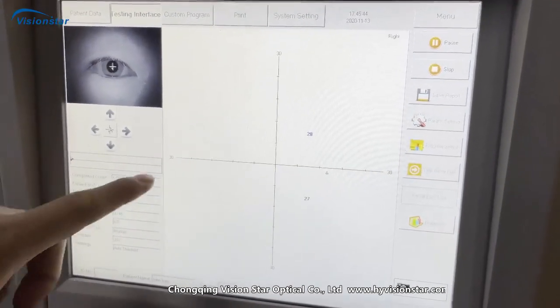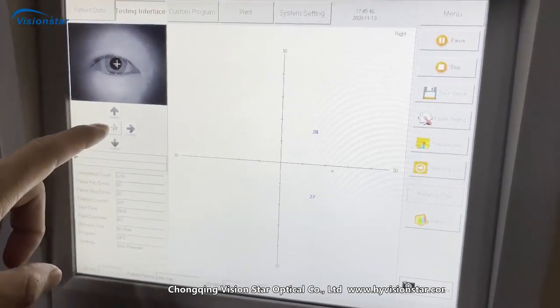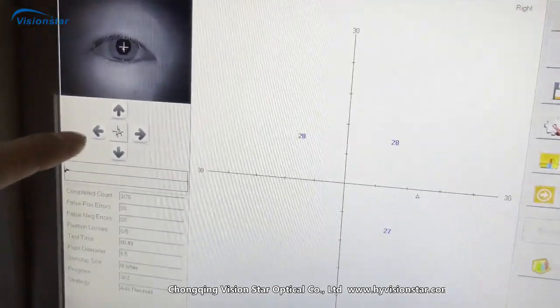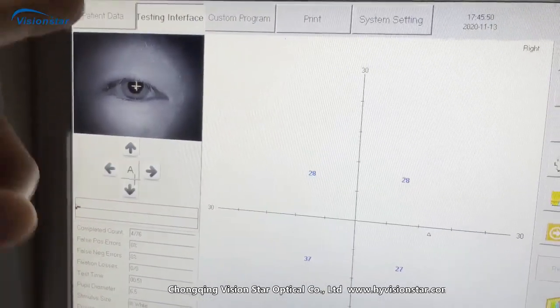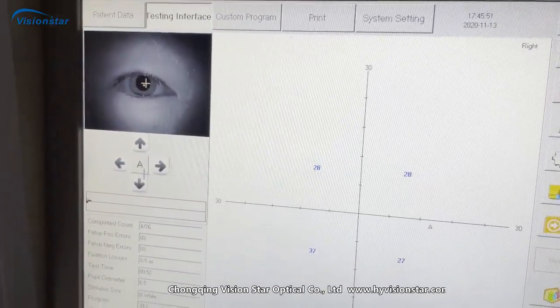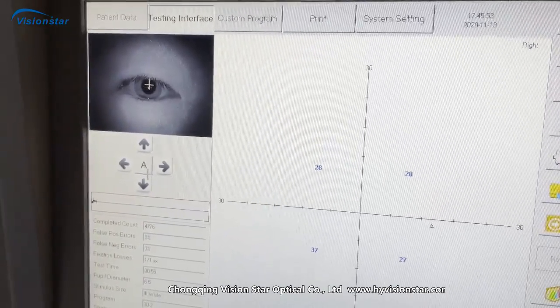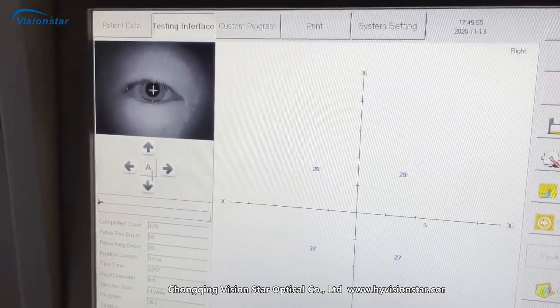If you press the button this is A means automatic model, so you can adjust the chinrest directly. The chinrest will move automatically.